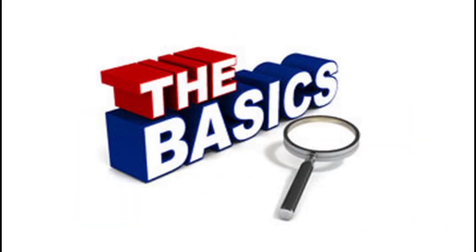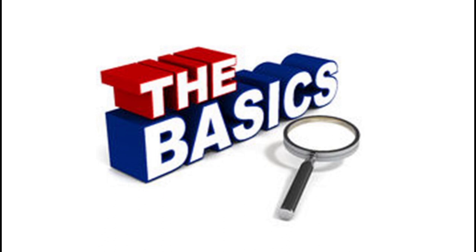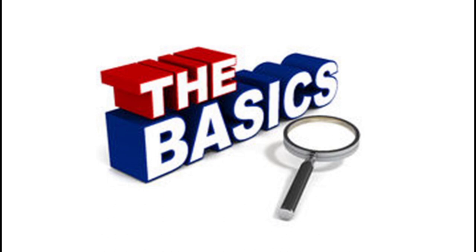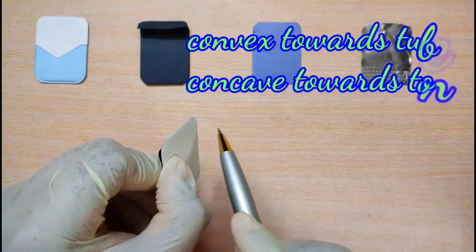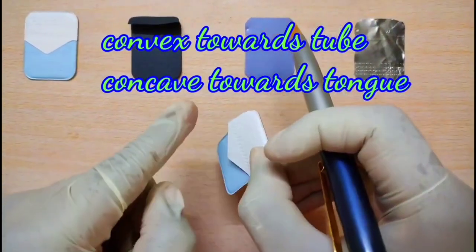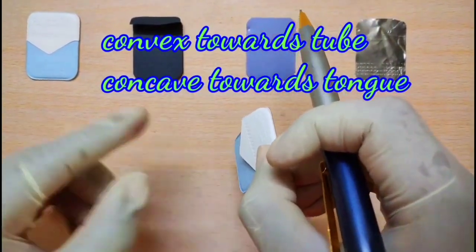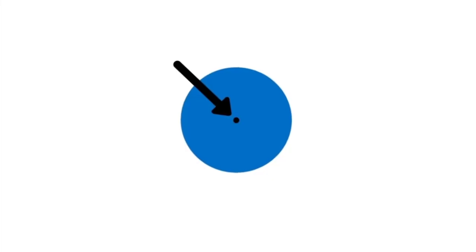Let's see the basics first. In my previous video I would have explained how to orient the film, i.e. the tube side with the embossing dot should face towards the tube and the label side with the tongue-like flap towards the tongue. The tooth to be radiographed should be exactly in the center of the film for all teeth except for the third molars.